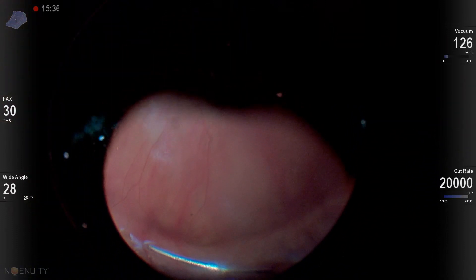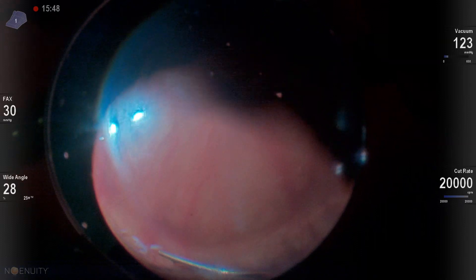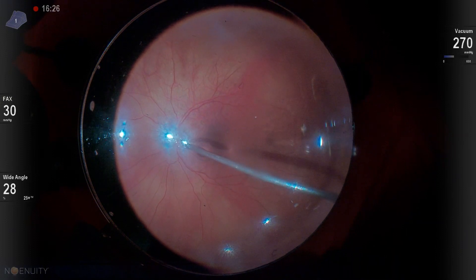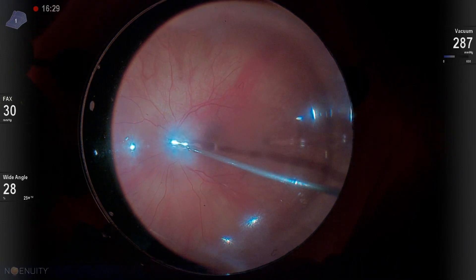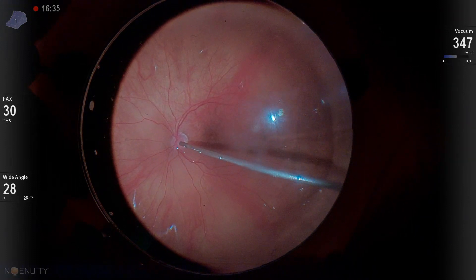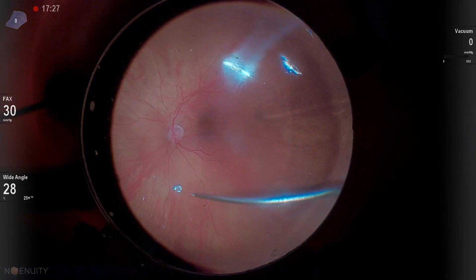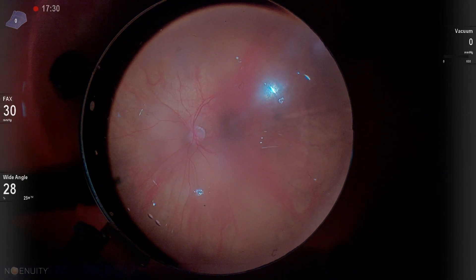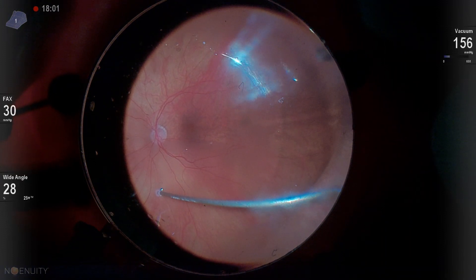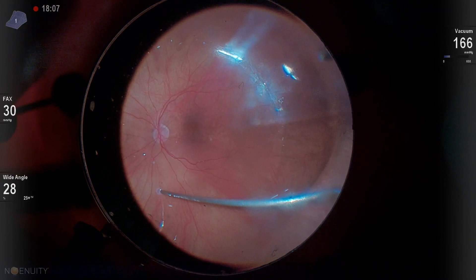This also allows me to do a little vitrectomy under air. I'm draining and shaving down over the anterior aspect of my tear, and if I see any additional vitreous, I'll remove it. Now I've gone back to the soft tip to complete my air-fluid exchange. This was a superior macula-splitting retinal detachment, so there's some subretinal fluid left. When you fill the eye with air, that subretinal fluid is going to migrate posteriorly. I create a draining retinotomy as nasal and as superior as I can, and fortunately it's right in line with my primary break. Now I'm going to drain through that draining retinotomy with my soft tip.